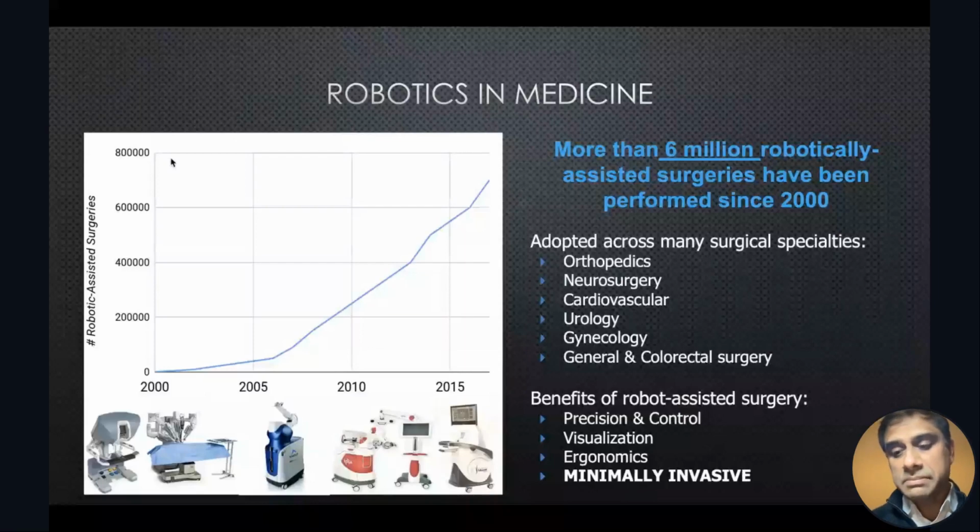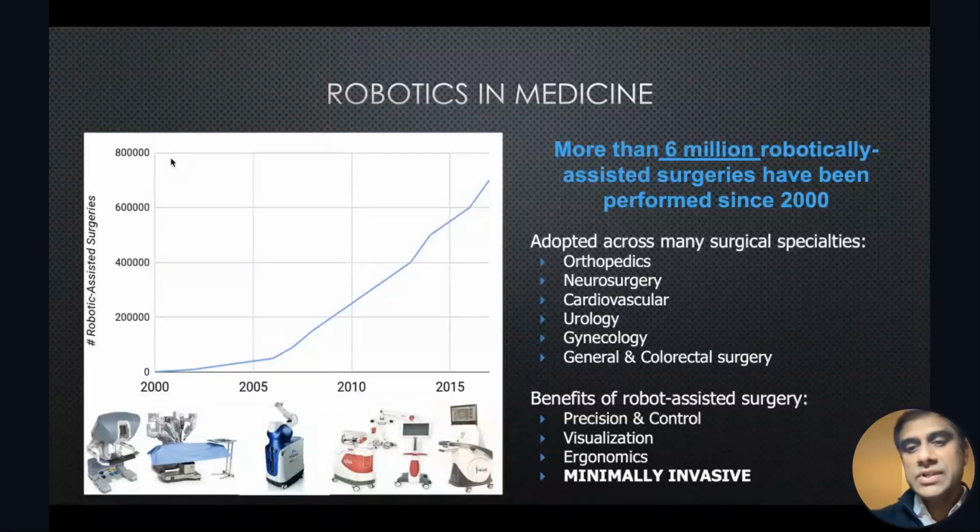It's absolutely amazing how robotics can completely change the way this same heart or cardiothoracic procedure can be performed by a robot, wherein recovery is quick. Compared to a big deep incision on the chest, you just have a couple of holes where the robotic arm can go right in. So recovery is amazing. And those kinds of discussions are happening today.